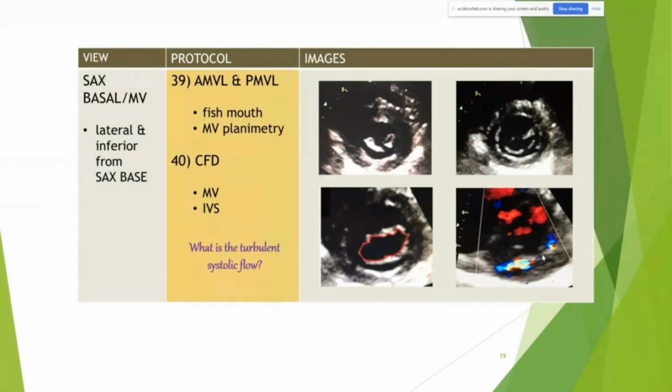Okay. So once again, what is this turbulent flow right here? That's the mitral valve regurgitation. Yes. Thank you.